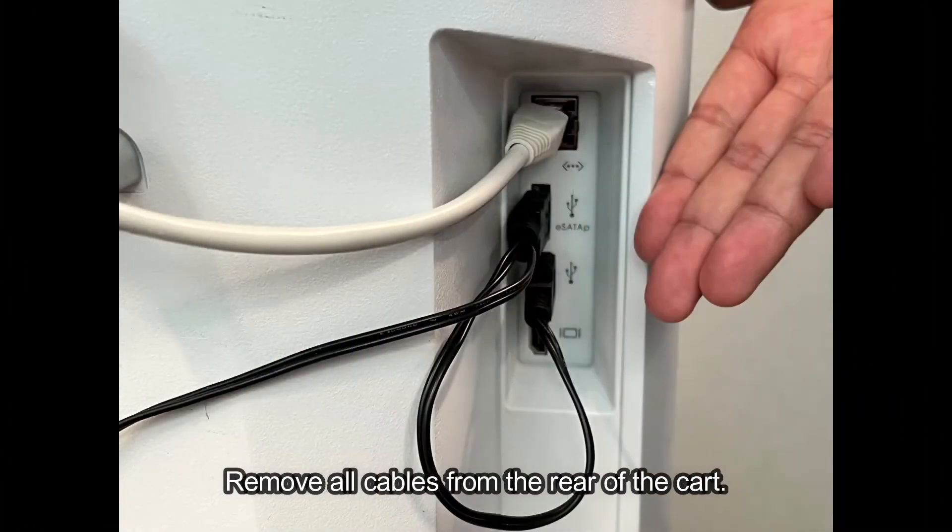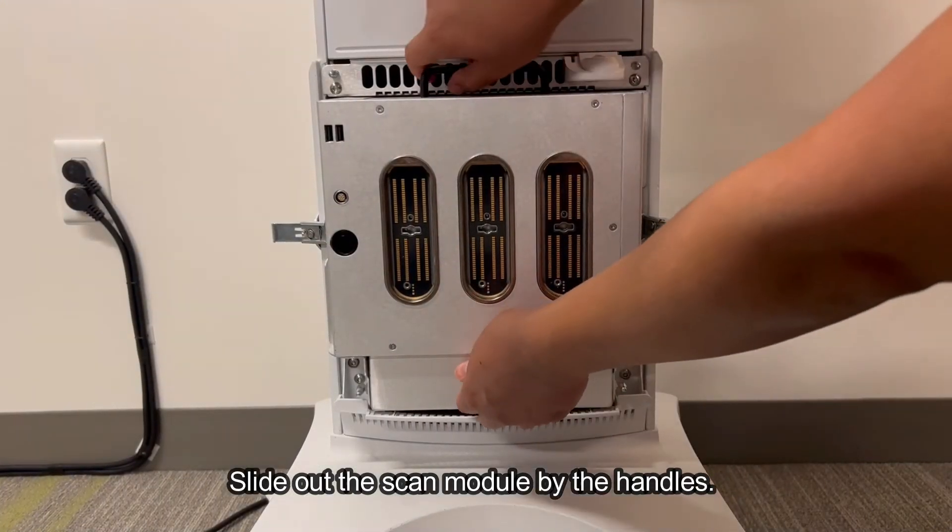Remove all cables from the rear of the cart. Slide out the scan module by the handles.